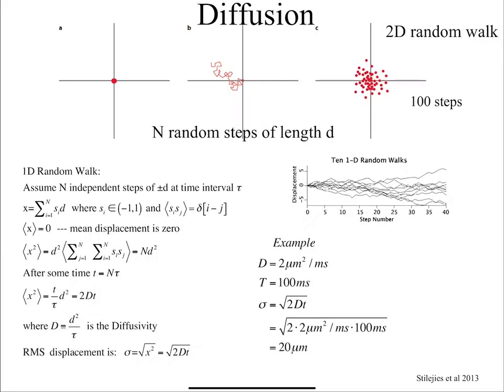Okay. So the next thing we're going to talk about is diffusion, and once again, we're just going to give a very high-level view of diffusion. So diffusion, as you all know, is the random motion of particles. And for most of what we'll talk about, we're really concerned about the random motion of water, okay, which is constantly diffusing in your body right now. If it wasn't diffusing, you would all die. We would all die, right? I mean, it's setting up gradients and all sorts of wonderful things right now, okay?